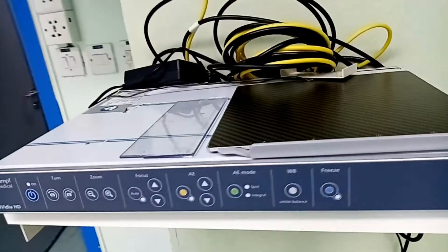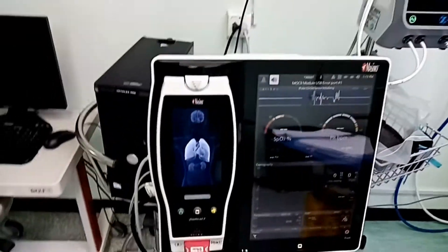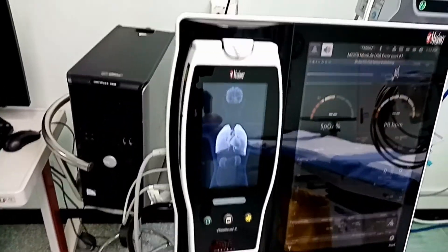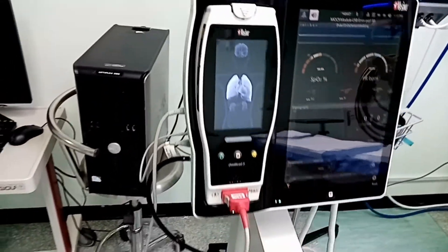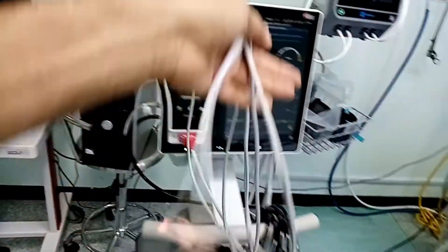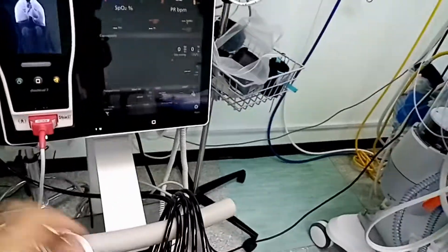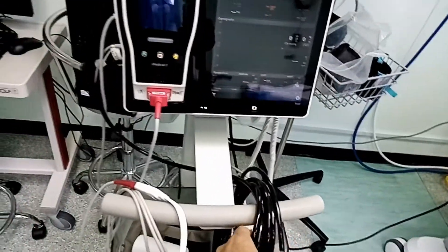احنا حبينا نوضح لكم التجهيزات اللي موجودة في غرف العمليات. ده جهاز المونيتور، كل أجهزة المونيتور بتستخدم لقياس الضغط ونسبة تشبع الأكسجين في الدم، وممكن أعمل تخطيط قلب وقياس الحرارة. ودي الكابلات أو الملحقات الخاصة بجهاز المونيتور.